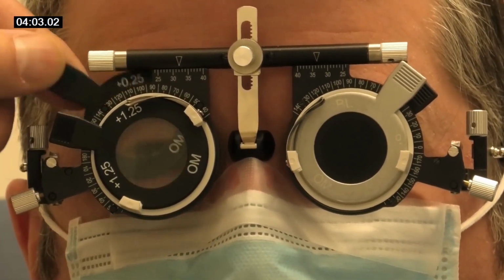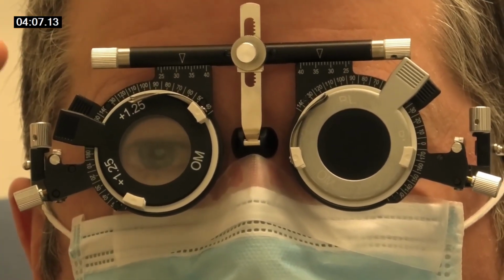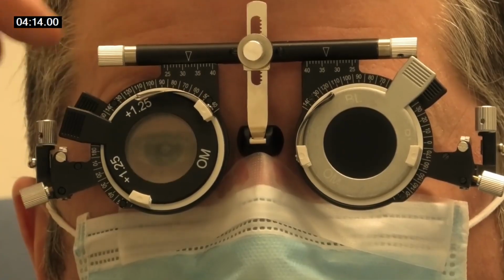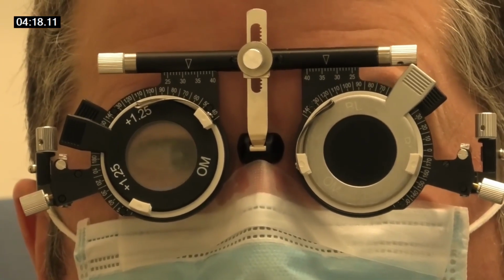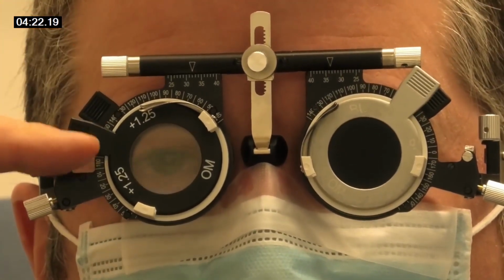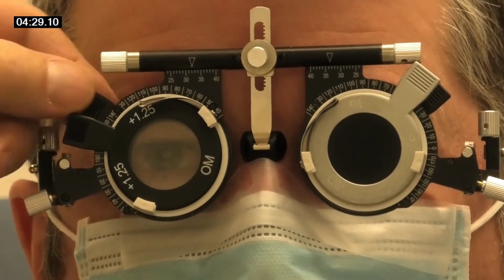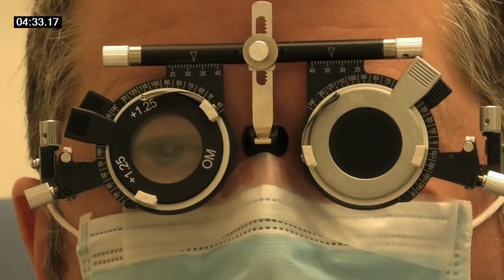So you've done this, you've blurred it up now. Okay. So you've used +1.25 to decide. So in fact, what you're saying is that the sphere should be plus 0.5. Is that what you're saying? Because it's 0.25 at the moment, and 1.25 makes plus 0.5. So what you're saying is that you feel that that one should be plus 0.50, is it? Yeah. Okay, let's change it then. That's fine.